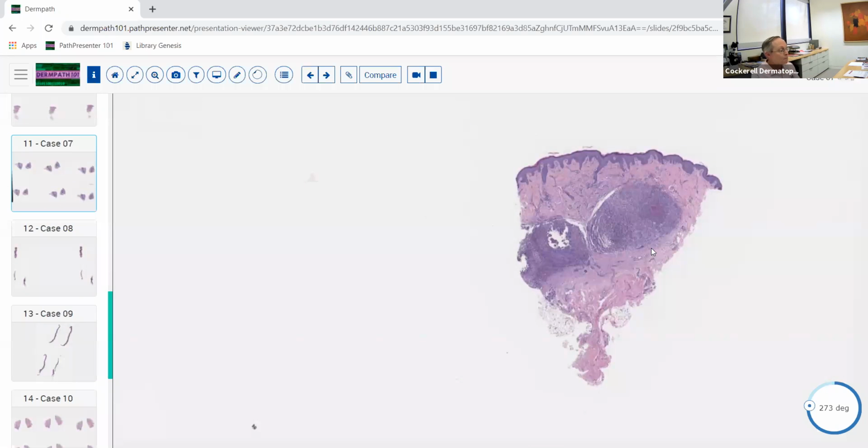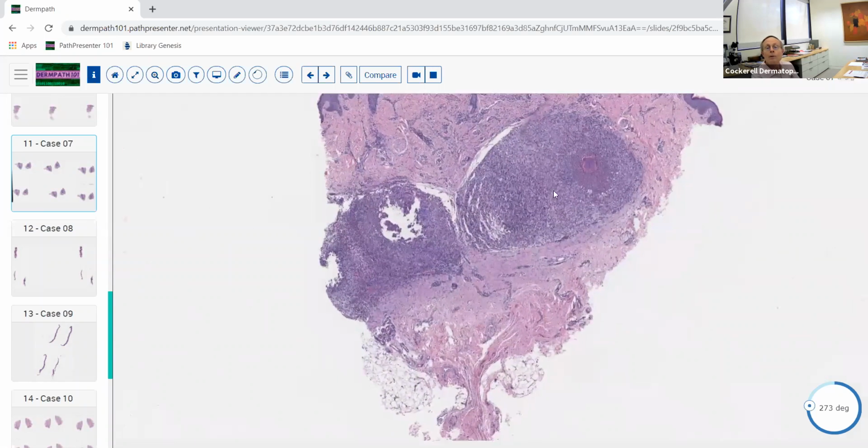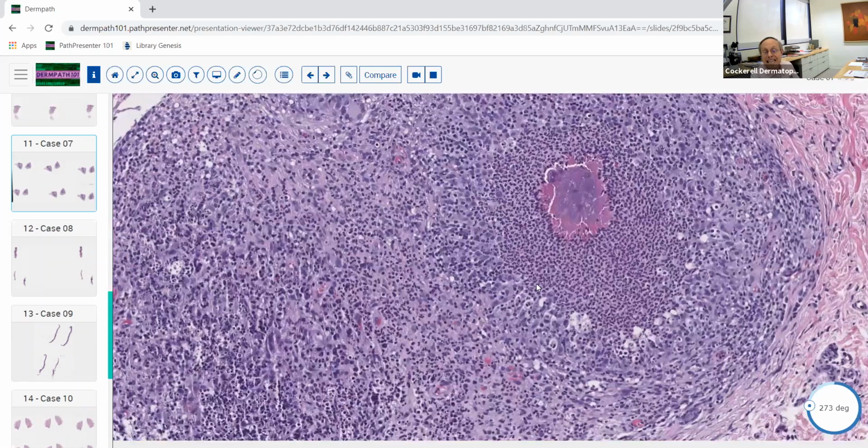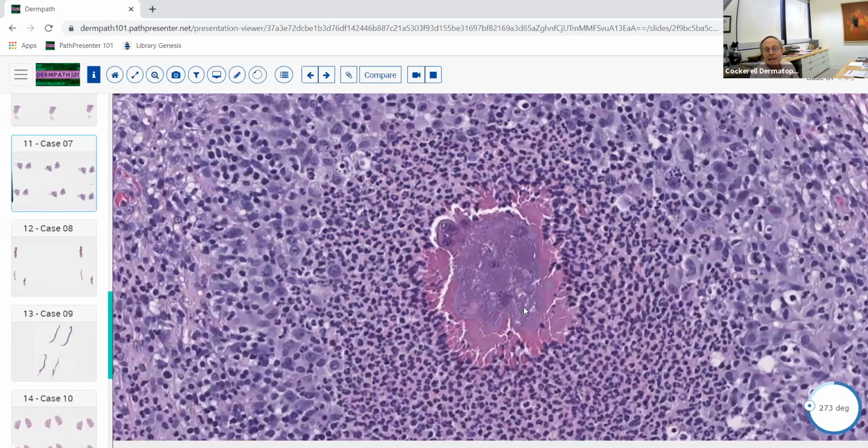Now the next case, different. We've got a suppurative granulomatous inflammatory reaction again. And notice this time we have a grain in tissue. Grain, okay? So anytime you've got a grain, it throws you to really just about three main items in the differential diagnosis. You get a grain from pyogenic bacteria that form a colony in the skin, usually in an immunocompromised patient. You get a grain in somebody that has actinomycosis. Usually that's seen around the jaw area.